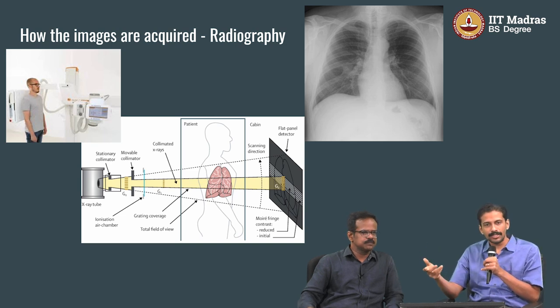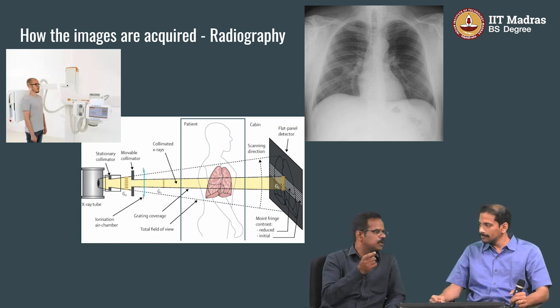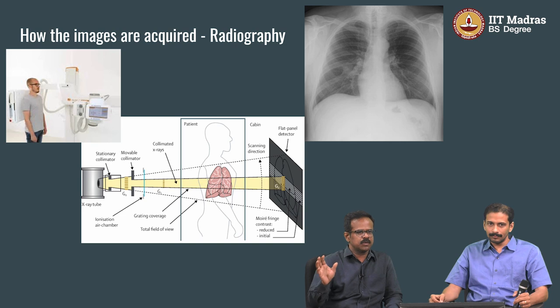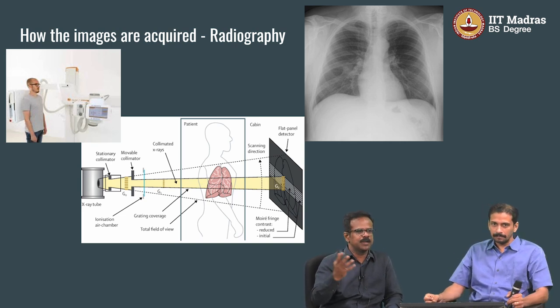There are a lot of harmful effects too. It's not only a question of training. Yes, it is not possible to accurately take it. The radiographer will approximately set a parameter. It may come out good or not, depending on your photograph.